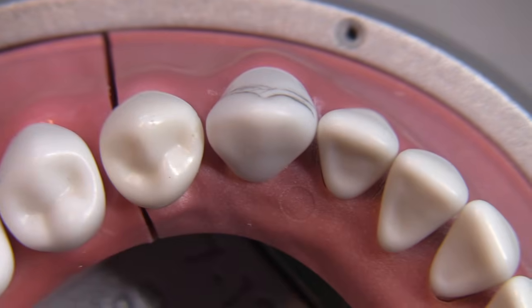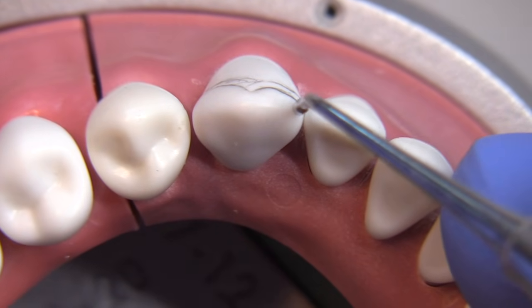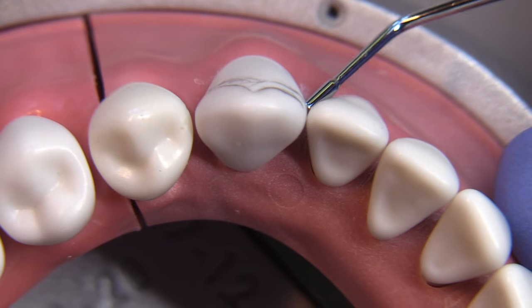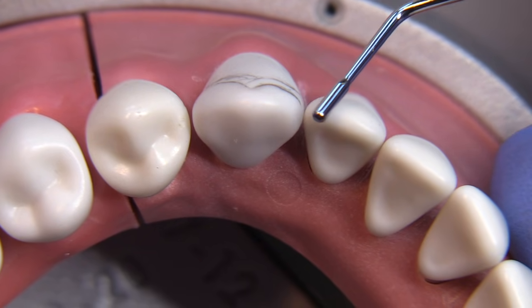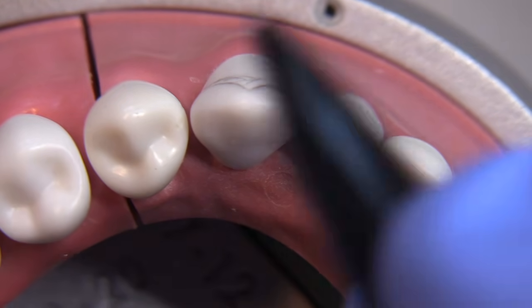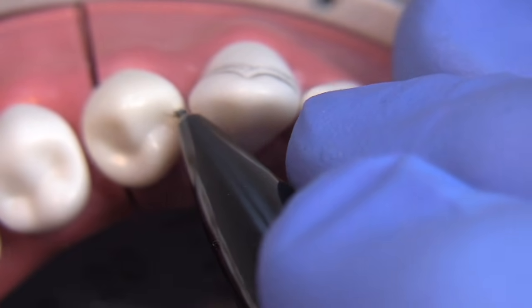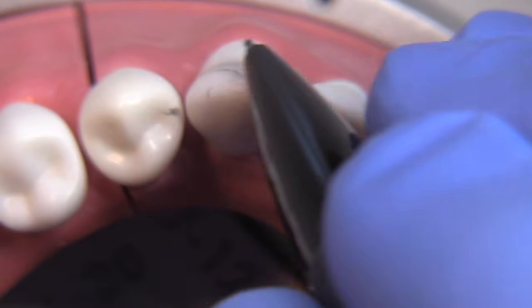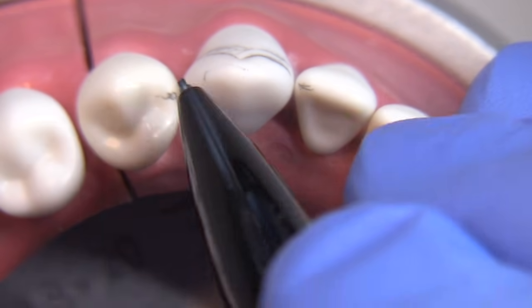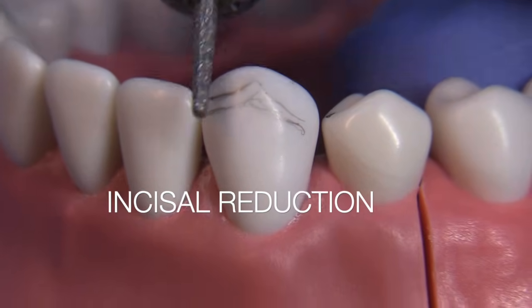We'll try to provide approximately 1.5 to 2 millimeter tall axial wall on the lingual. One of the most important parts of a PFM is to know where the shoulder stops and where the chamfer begins. When you have a tooth in the anterior like this, the shoulder location is really critical — it needs to go interproximal. Mark those interproximal locations as the termination of the shoulder. The shoulder must go all the way from one side to the other; the lingual is going to be chamfer, with transitional areas between.